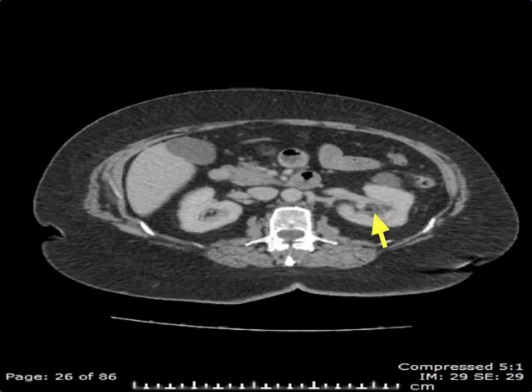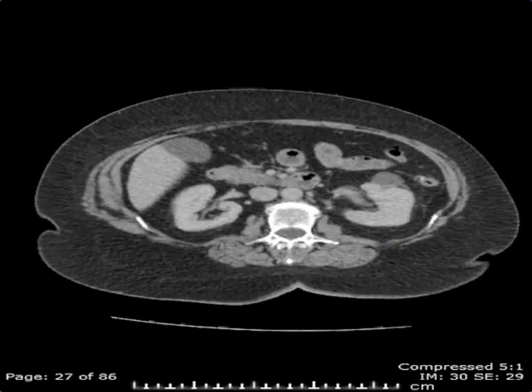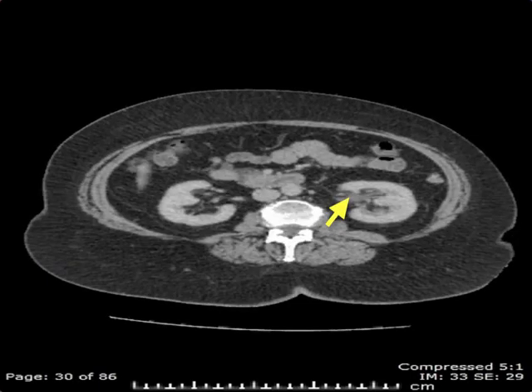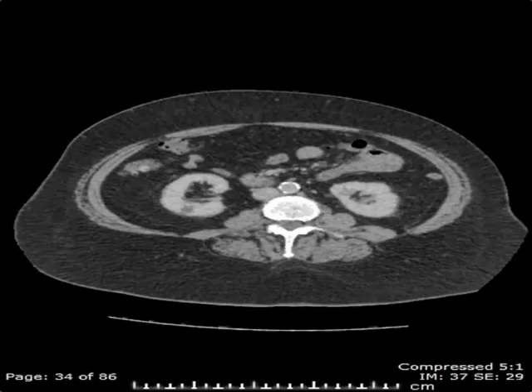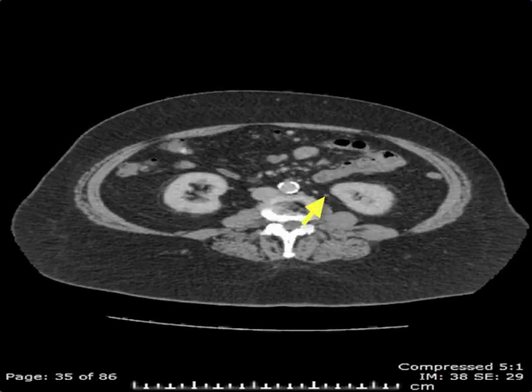We can also see the collecting systems, which join to form the renal pelvis, and subsequently the ureters as they course inferiorly to the pelvis.